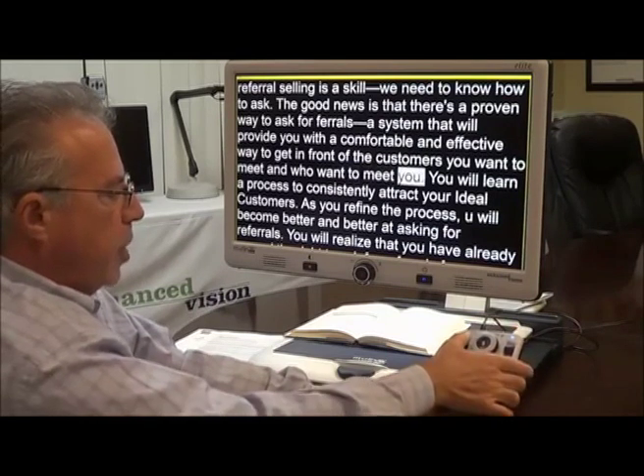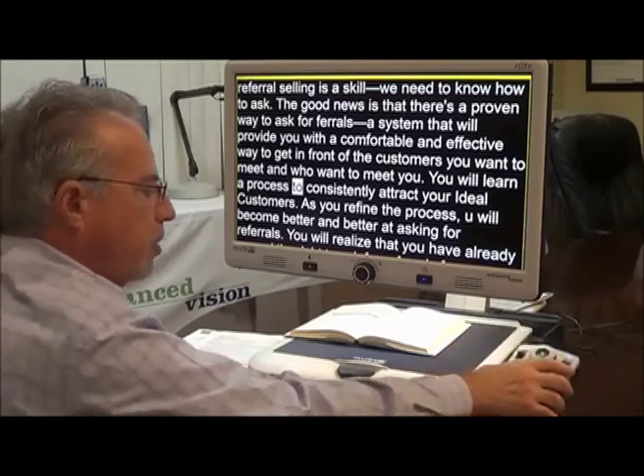I can change the speed, and I can change the volume, should I choose to do that.